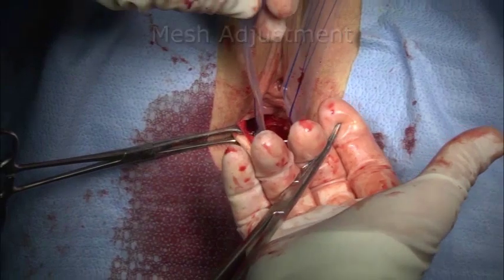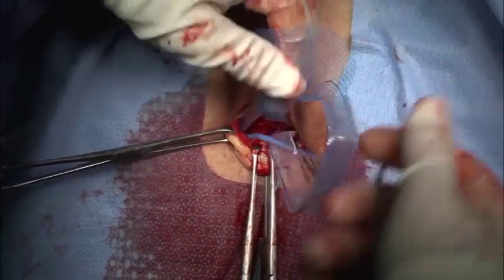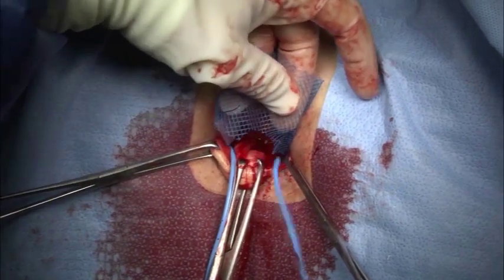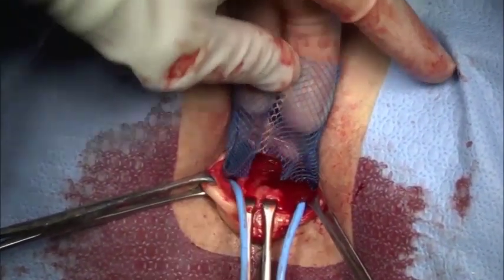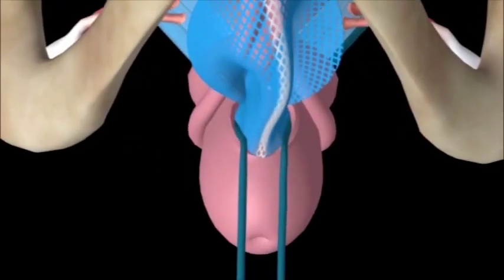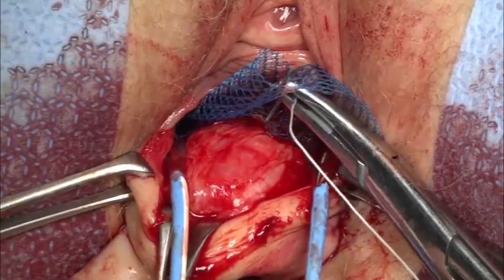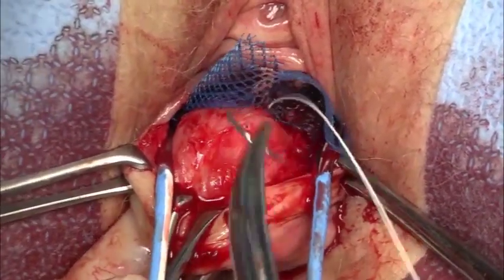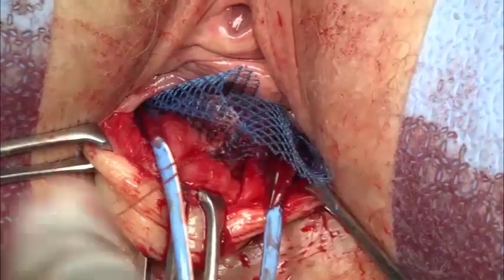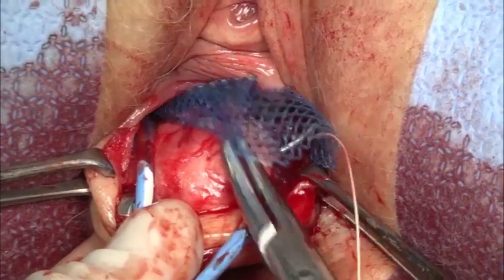At this point, I prefer to position the mesh closer to the apical portion of the repair. This enables the mesh to be affixed to the paracervical ring or vaginal apex if desired. Typically, I accomplish this with three absorbable sutures. I begin by placing one suture tie at the natural center line 12 o'clock position to the center of the apex, or right into the firm cervical stroma when present. I repeat for the 9 o'clock and 3 o'clock positions. The idea is to recreate the paracervical ring with this tapered portion of the mesh.